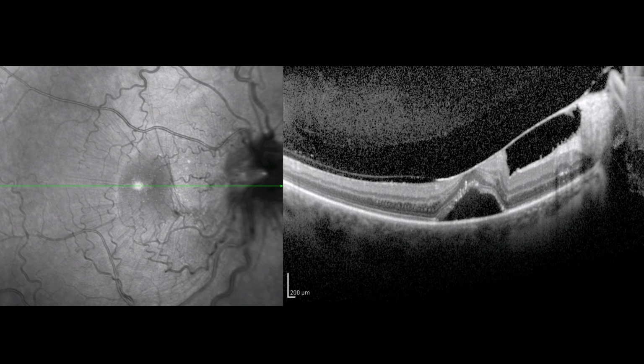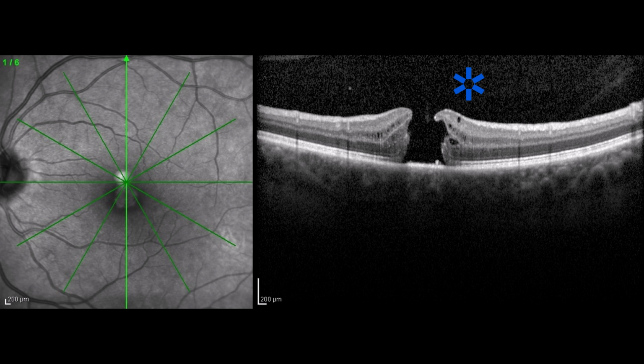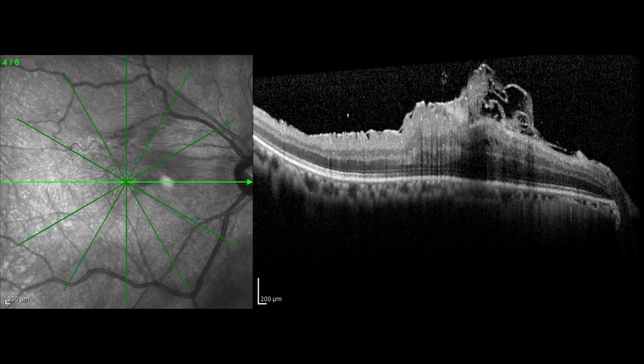No diagnostic dilemma here: subretinal fluid, but a really bad VMT, ERM. And I also put some blue asterisks in here where they're pretty darn near close to pathognomonic. If anybody wants to say, hey, I've seen something else that looks like that, well, this is always a macular hole, so this is so obvious. Please raise your hand.